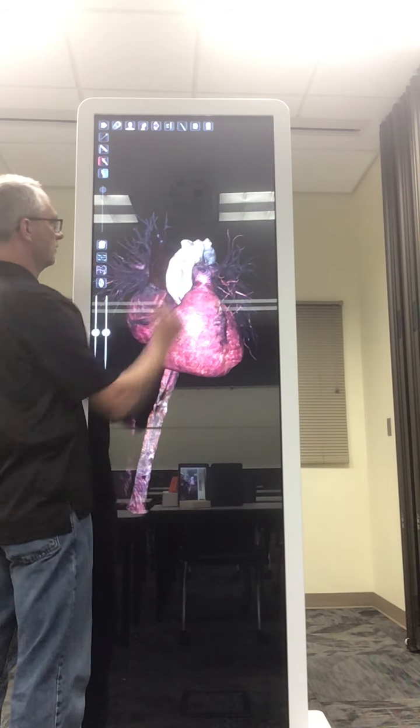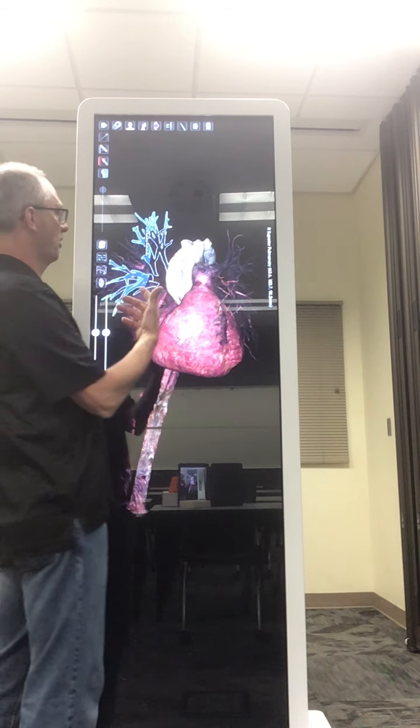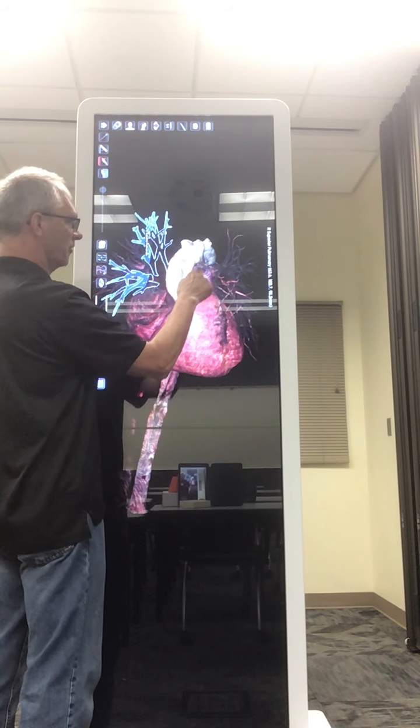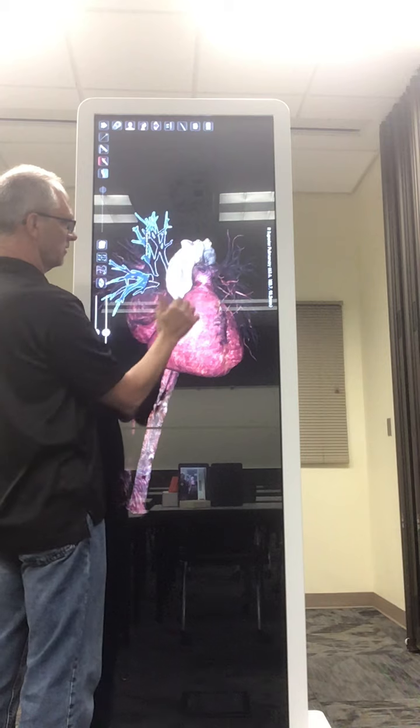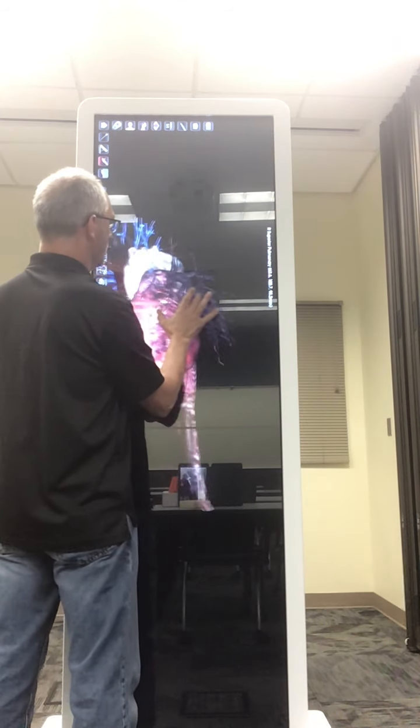Splits into left and right. Yeah, so left and right, the label, there we go. So you can see the pulmonary trunk comes from the right ventricle, splits left and right and goes out to the lungs. Are you able to see pulmonary veins buttons on here?